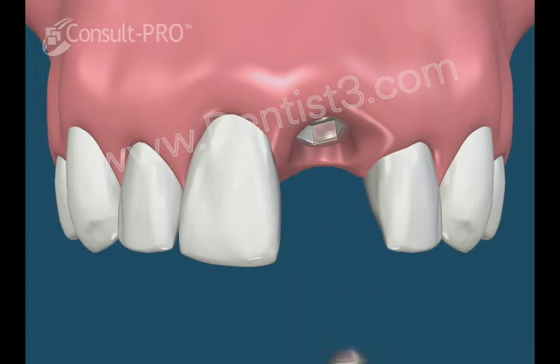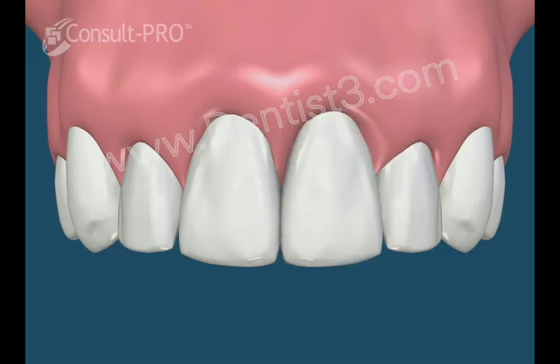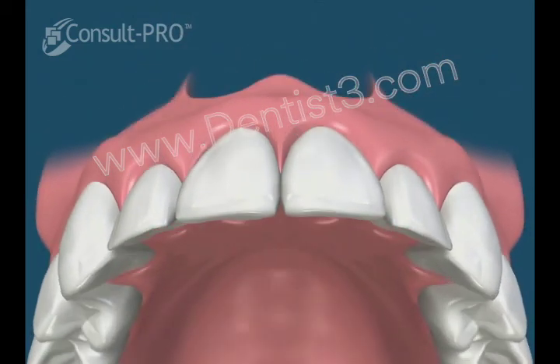After a healing period, the healing cap is replaced with a post and core and crown. This combination of techniques may not always be possible and can only be determined at the time of the tooth extraction.